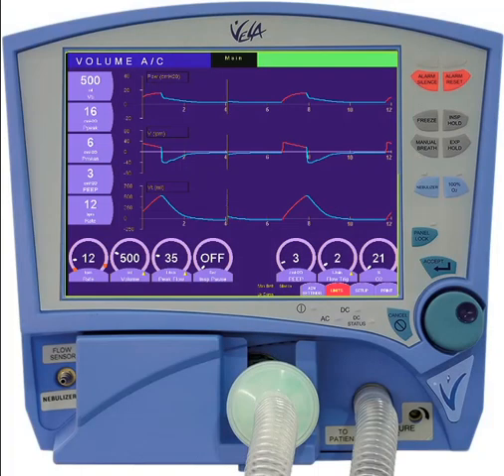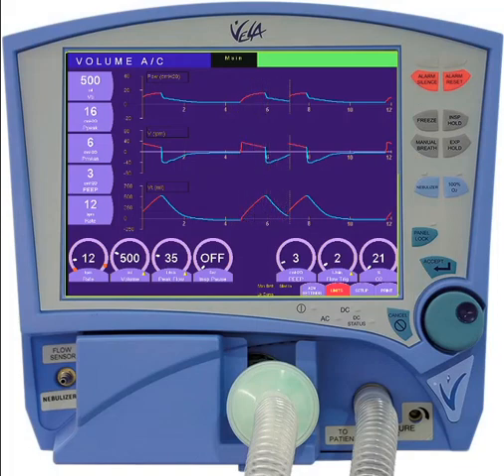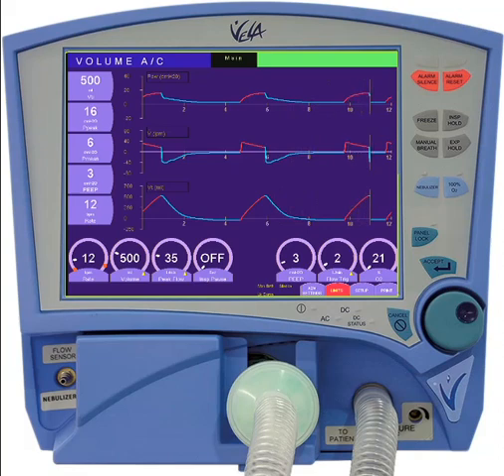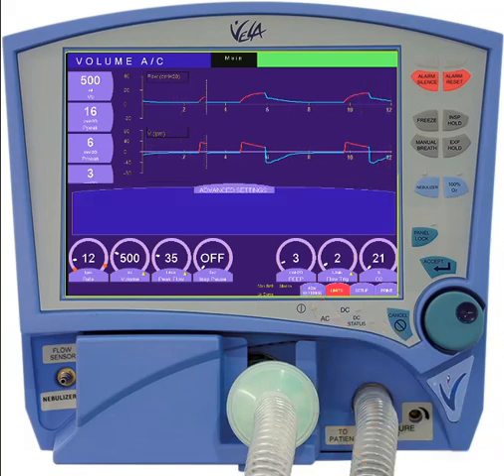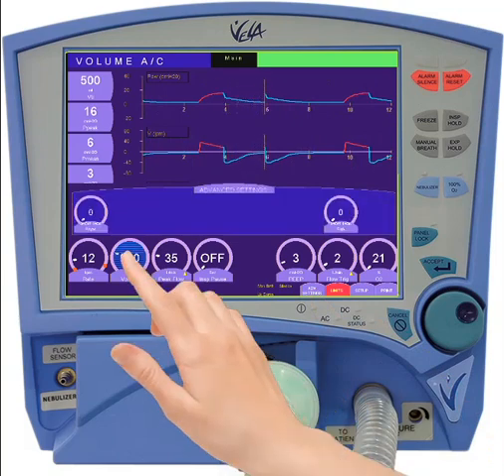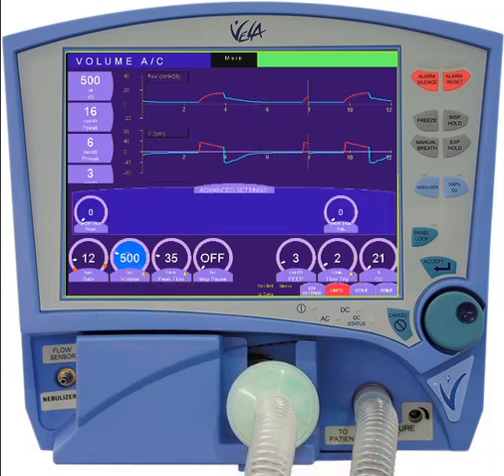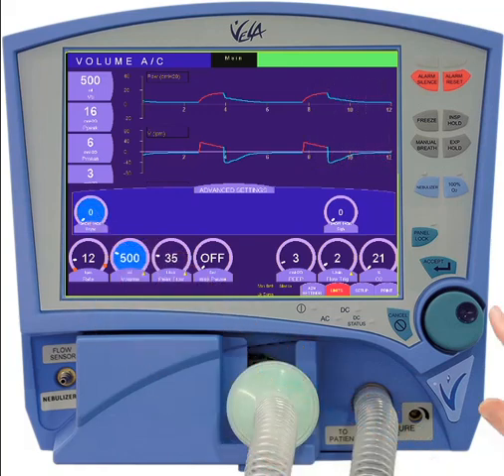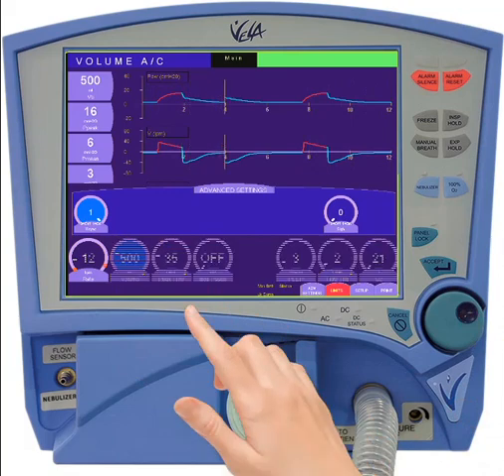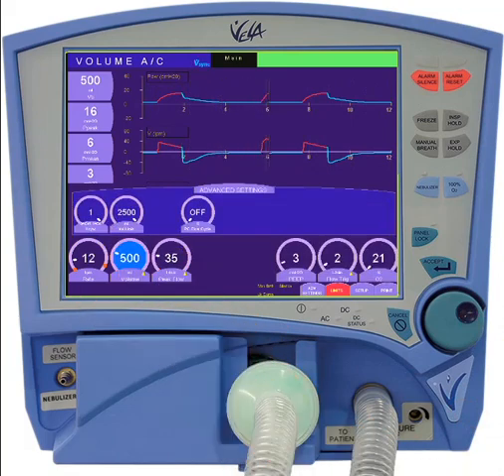Some primary controls on the Vela feature advanced settings. These controls can be identified by the yellow menu triangles on the control label. To access the advanced settings menu, press the advanced settings button on the display, then select the desired control. Change the advanced setting using the same three-step touch-turn-touch process as for a primary control.